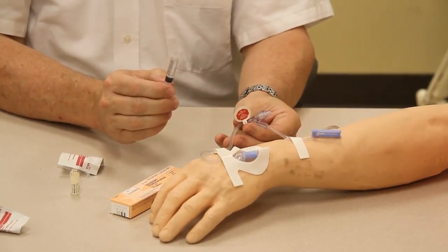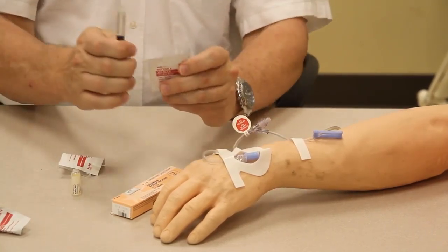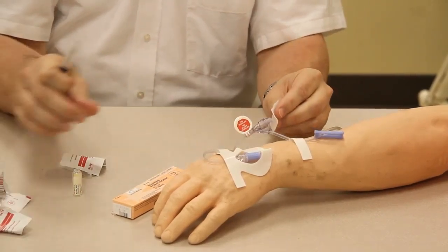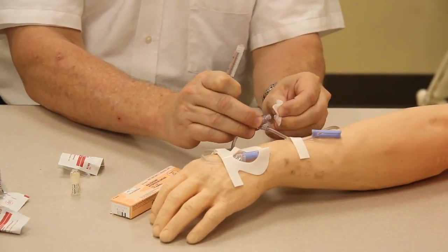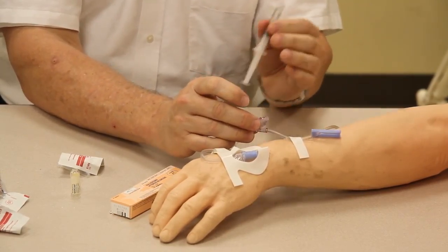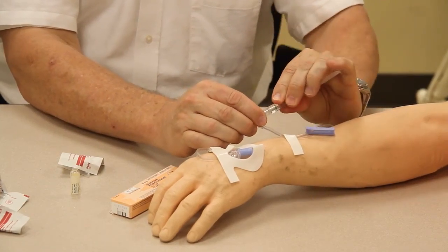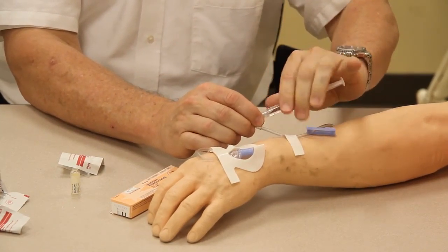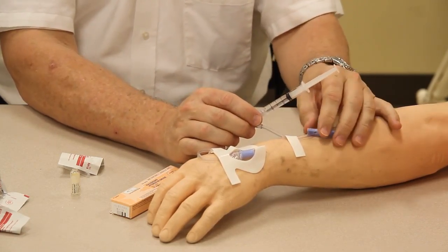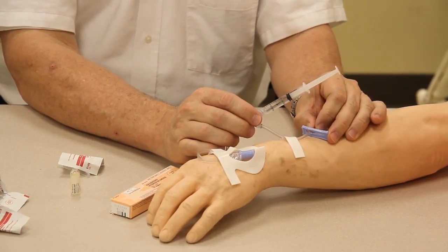Now this particular IV set has a luer lock on it, and this is a luer lock syringe. But even though that's a luer lock syringe, the end of my syringe is still sterile, but I don't know where this has been. So I'm going to clean off the end of my luer lock, and then I'm going to place the syringe on my luer lock and twist so that it actually locks on.